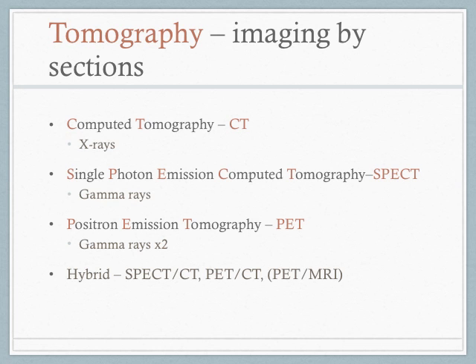We know computed tomography, or CT, which is external X-rays, and then generated by a computer to form a single image. The SPECT scanner picks up the radiation in the form of gamma rays from the decay of gallium, indium, and technetium to form a tomographic image.